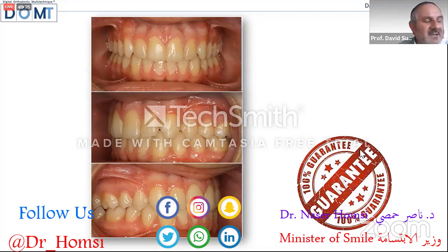No, the question is very simple. The first step is I use a lot of mini screws. In fact, I have mini screws, and I use a lot of mini screws. The lecture is two parts. The first part is about the mixed dentition, and the second part is the class 2 treatment. In my office, we treat the patient of class 2 with functional appliance and fixed appliance at the same time. Another question is the cooperation.